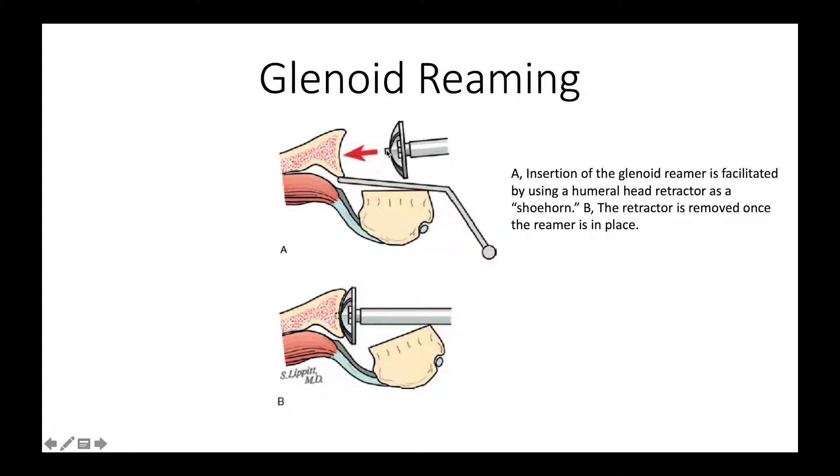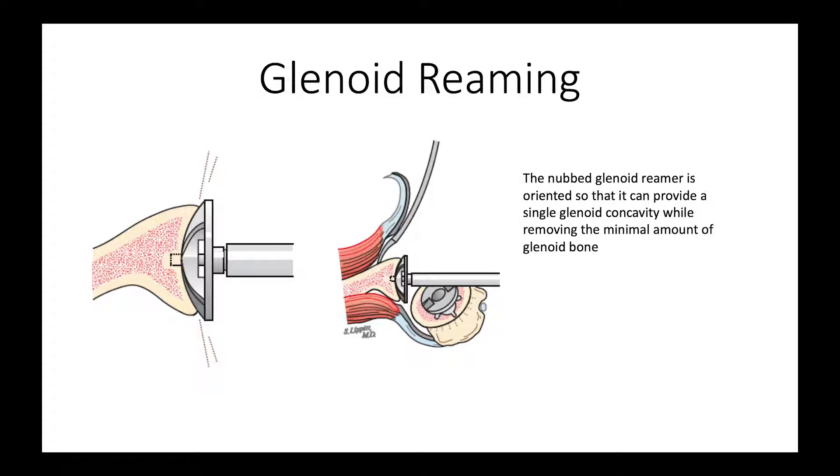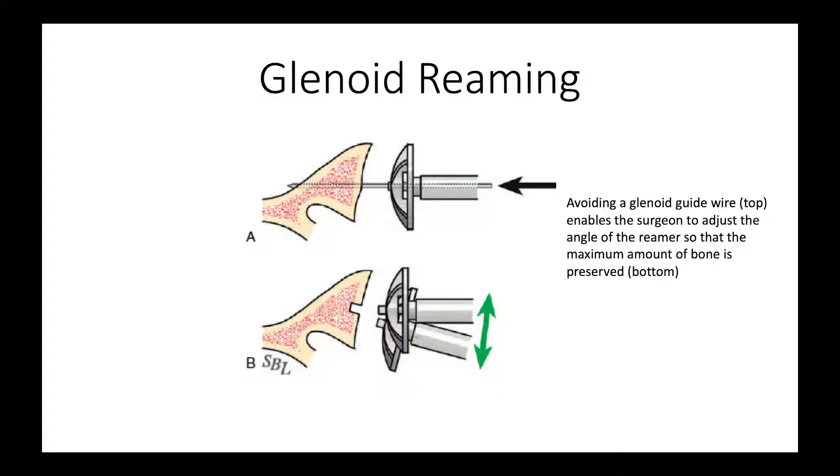We use a retractor to help shoehorn the glenoid reamer into the joint and then pull that retractor out so that we have good access of the reamer to the glenoid. We do not use a guide wire — the problem with a guide wire is it dictates exactly the orientation of the glenoid reamer. Instead, we use what we call a nubbed reamer that goes into a central pilot hole, and we can adjust the angle of this nubbed reamer so that we remove the smallest possible amount of bone. With the nubbed reamer, we can angle it posteriorly and preserve a substantial amount of glenoid bone stock.